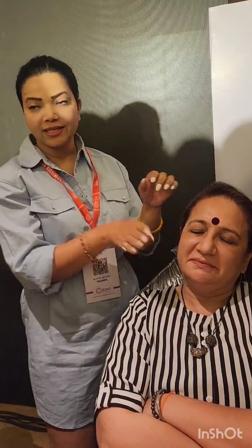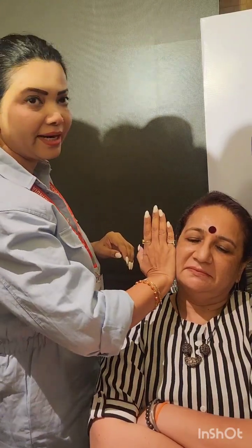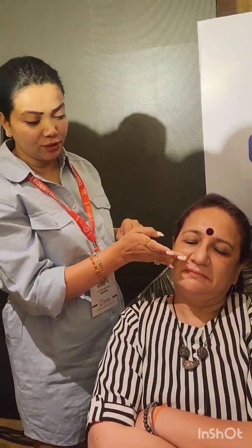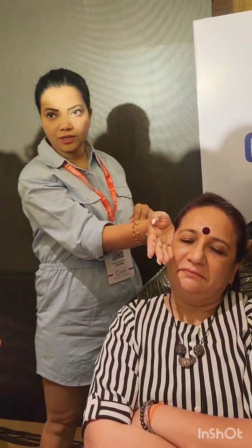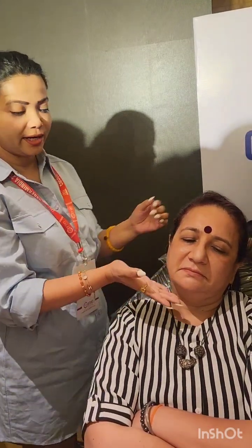So zone of action is the area you want to treat, the wrinkles, where the wrinkle or sagging is. The vectors will always be perpendicular to that. So for the nasolabial line, vectors will be perpendicular to that. For jowl, the vectors will be perpendicular like this. For neck, it will be like this. Okay? So these are called vectors.